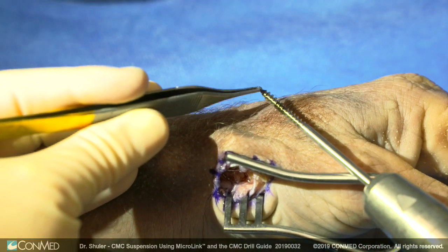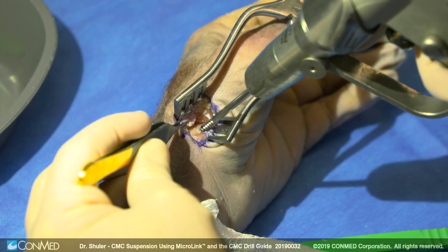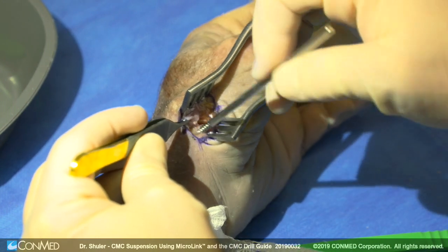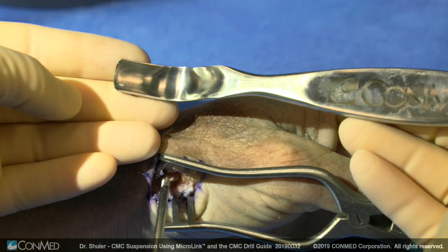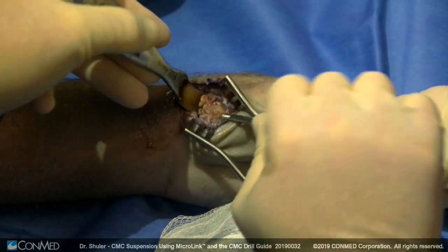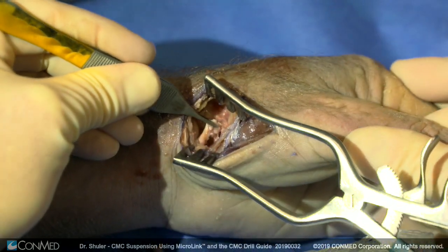The trapezial pin is inserted into the trapezium to allow it to be used as a joystick to circumferentially dissect sharply along the trapezium for excision of the trapezium as one piece. The McGlamory elevator is then used to elevate the soft tissues off the trapezium.